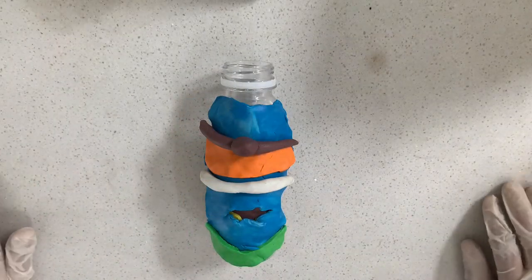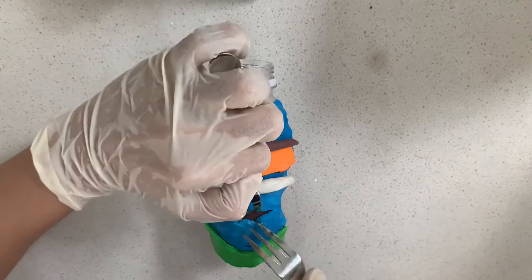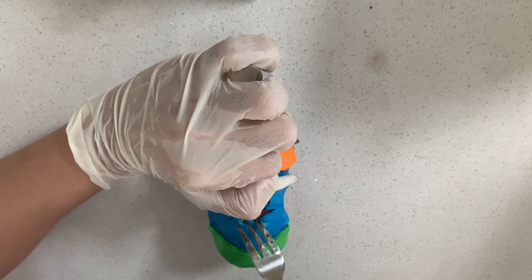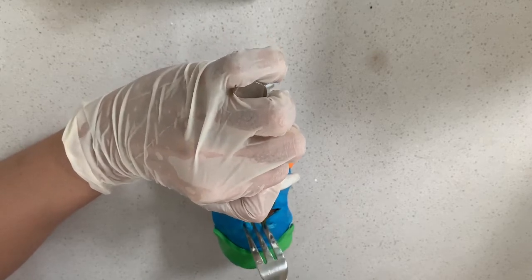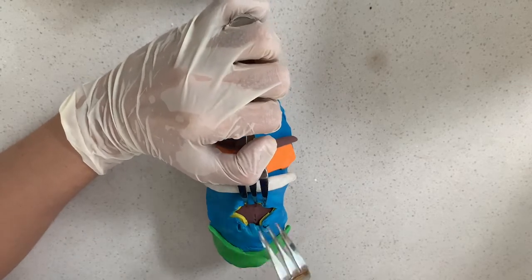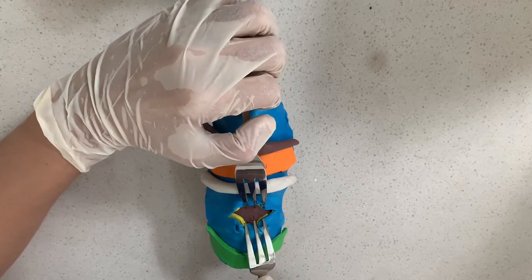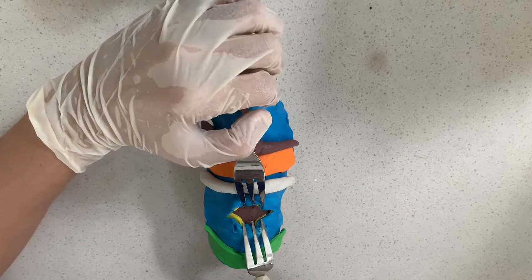Dissect towards the trachea by parting the tissues with scissors, remaining strictly in the midline in a vertical plane to avoid injury to the inferior thyroid veins. Identify the midline cervical fascial plane between the sternohyoid muscles. Divide this intermuscular plane by spreading with a pair of scissors.